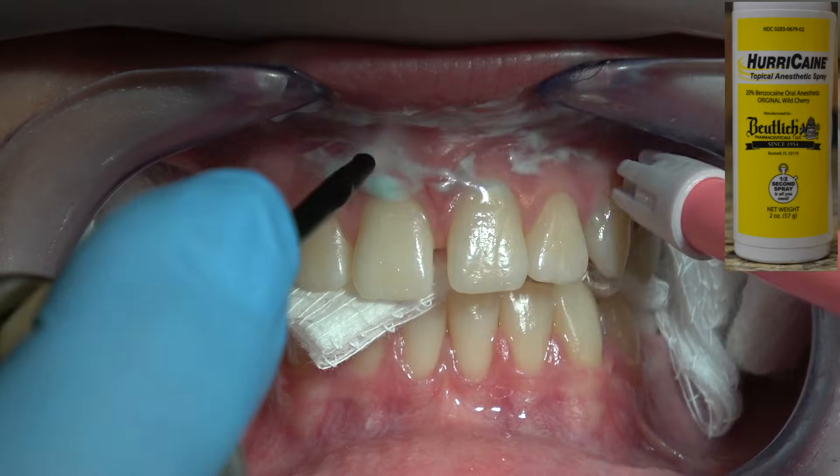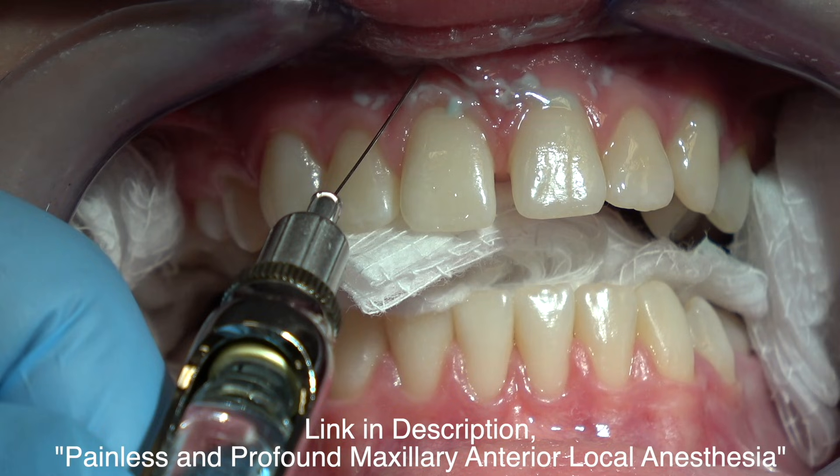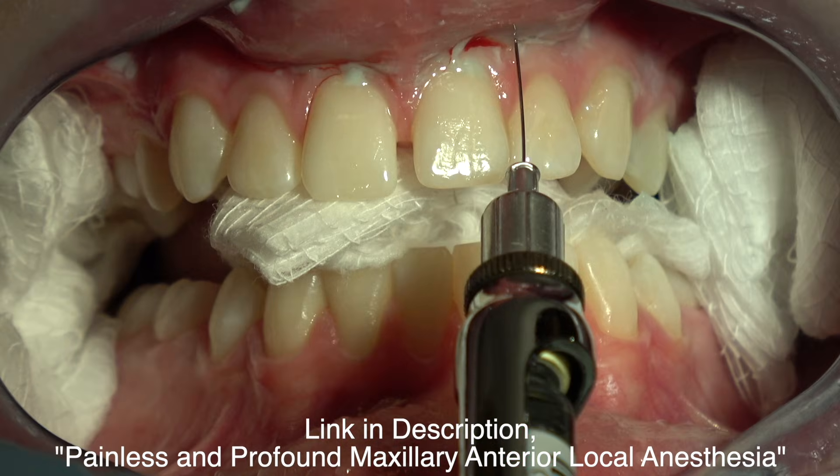Painless and profound. Local anesthesia is always an imperative part of any dental procedure. You don't want the patient to feel the injection or certainly to feel the procedure.